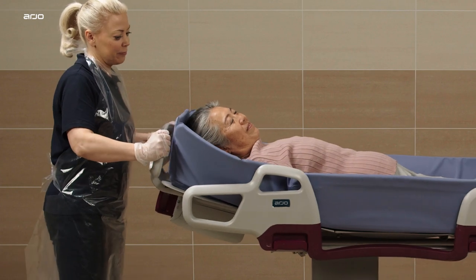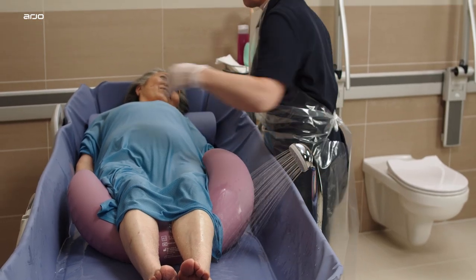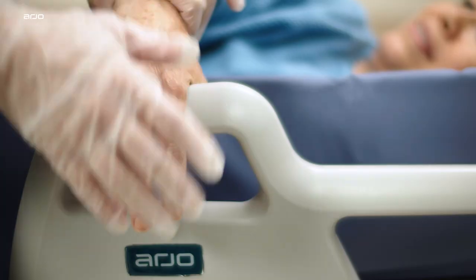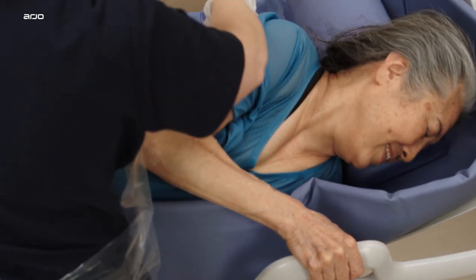There are two comfort handles located on the Corivo shower trolley, one on each side support. The patient or resident can use the comfort handle as support when laying on their side. Holding on to the comfort handle can add a sense of security or promote participation for the patient or resident.